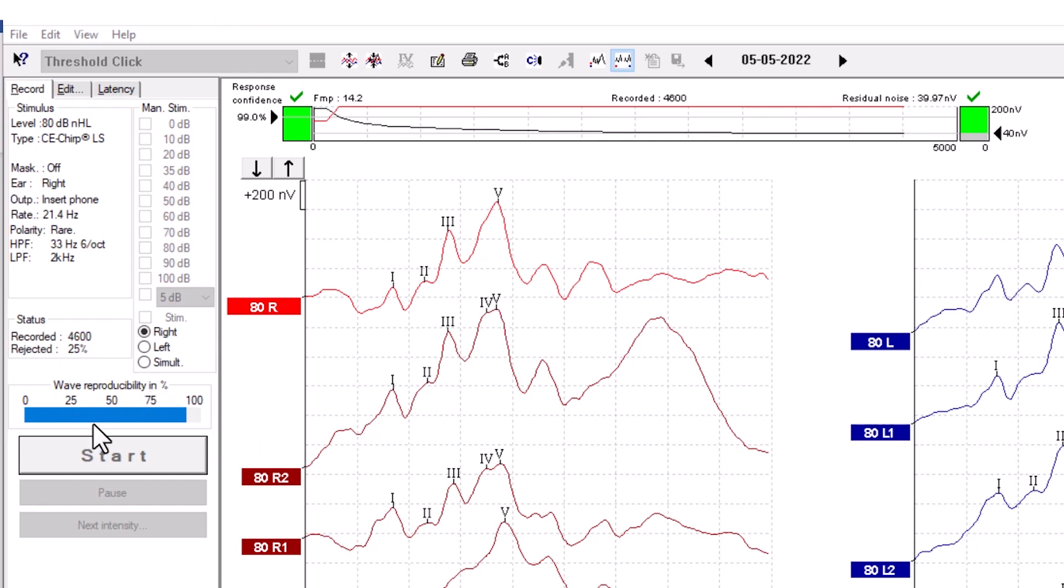When a test is performed, the A and B buffers each hold half of the responses. A correlation between the two curves is indicated using a percentage bar, and this is used to calculate the reproducibility of each wave.